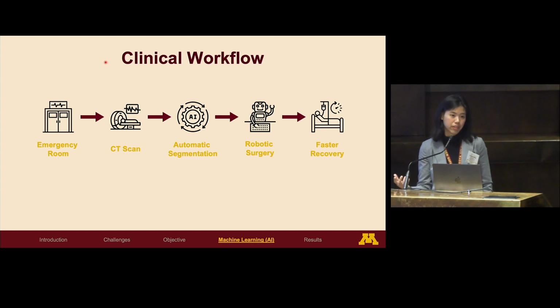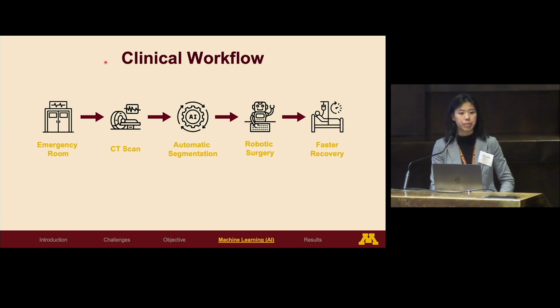If it's a normal head CT scan, it can wait in line on the usual CT scan schedule. But if this CT scan has some abnormalities, it will alert the radiologist, hey, this one has to go on top of the line, so that the patient who actually needs care gets help first, like a patient who has an emergency will get help immediately.